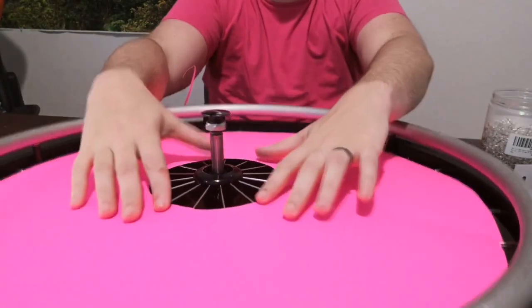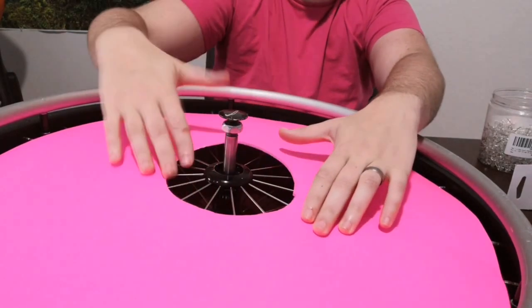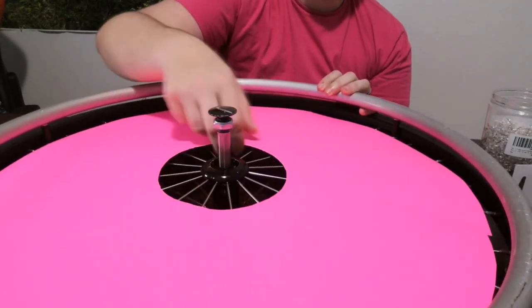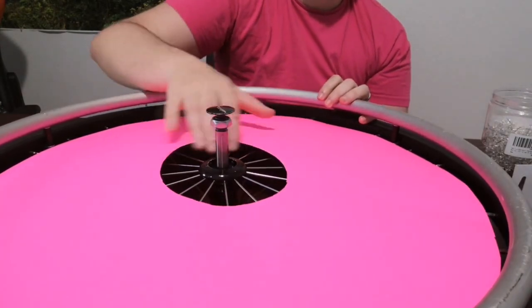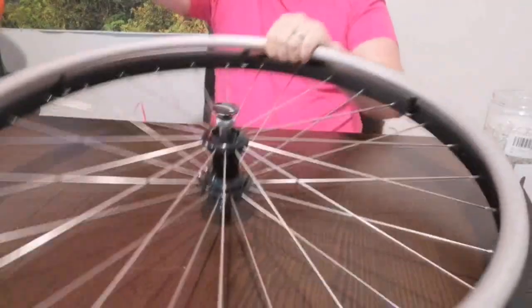Perfect. So now if you can see here, it's flat along the spokes, so I know that I have cut it enough. If it has a gap in here like this, you're going to want to cut it a little bit more until you've got it just right. I'm going to take it off the wheel for now, and this is where the laminating starts.